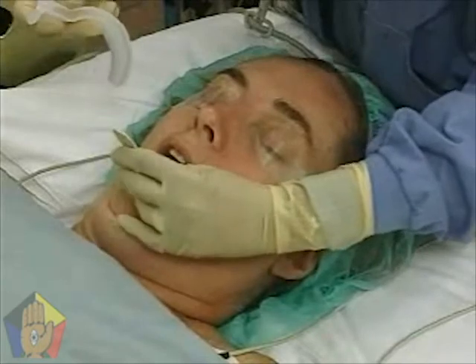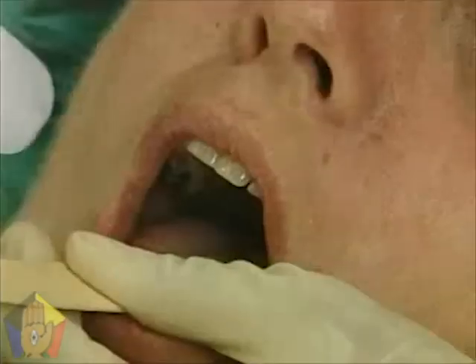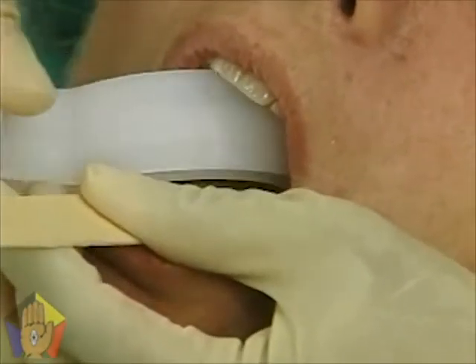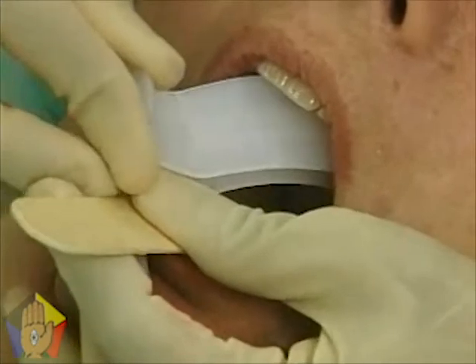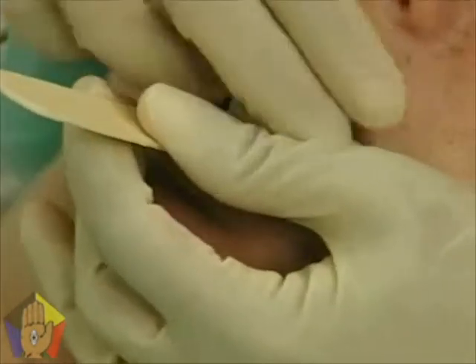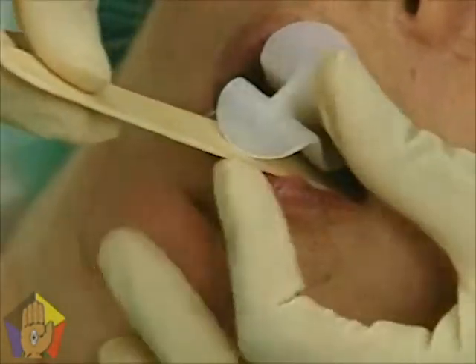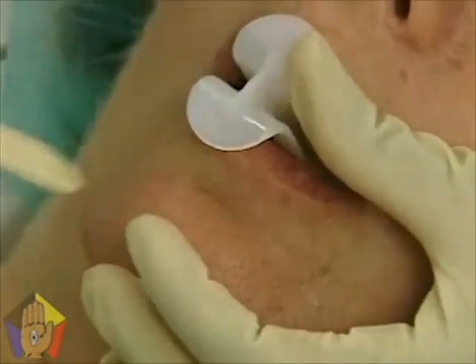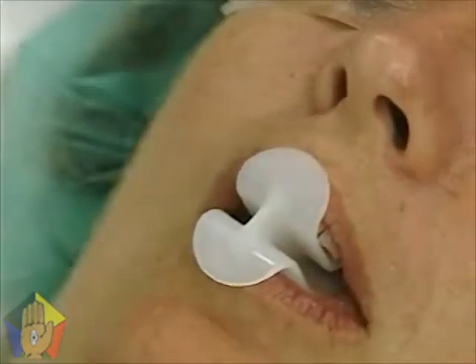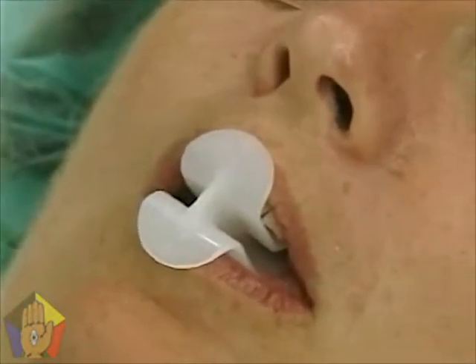Place the airway in the mouth with the concave side facing down so that the distal end is approximating but not touching the posterior wall of the oropharynx. The flange at 1 to 2 centimeters of the shaft of the airway should protrude above the incisors.